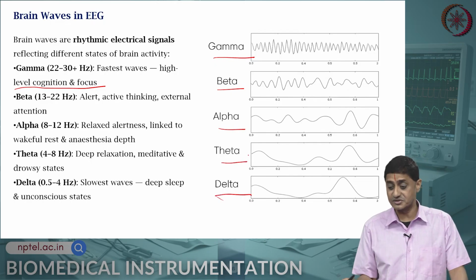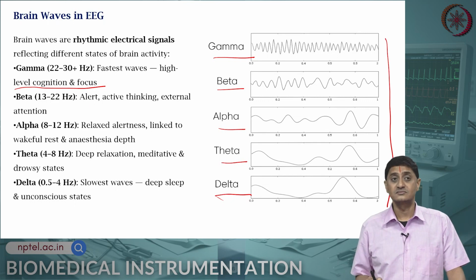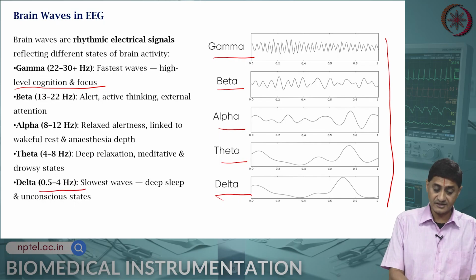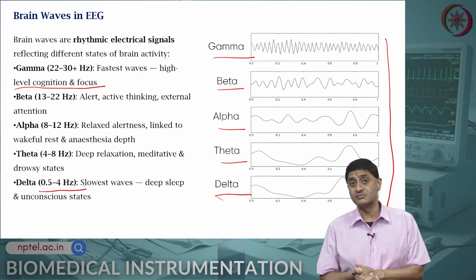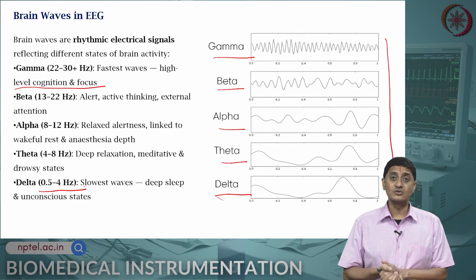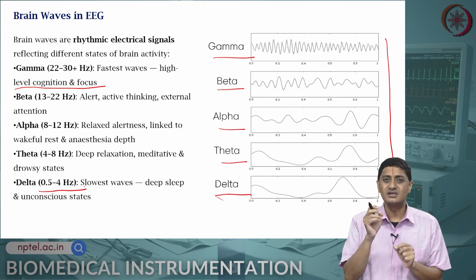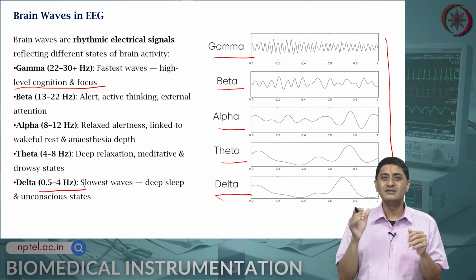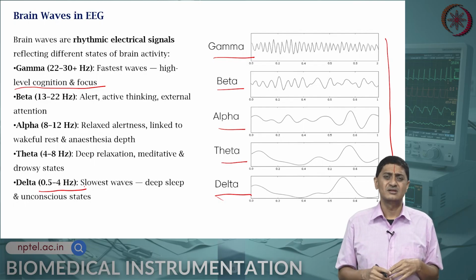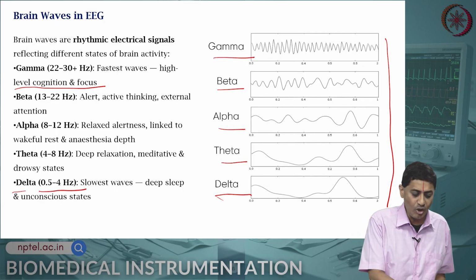Look at the frequencies, and note that the frequency ranges are relatively small, and if I am measuring from these scalp electrodes, even if the patient is not moving, there might be movement artifacts purely due to blood flow that could be reflected in these slow waves.